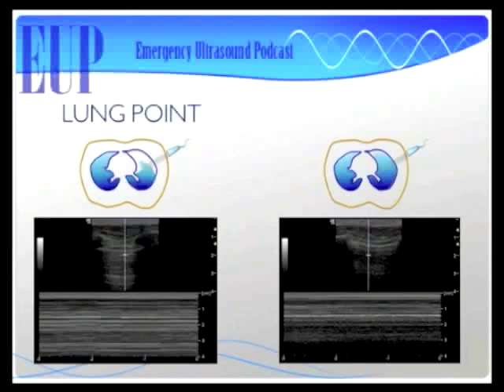Yeah, so think about it. Say you do your ultrasound initially right next to the sternum, and it's positive for pneumothorax, and then you start going laterally, and your lung point's like 3 centimeters away. That's a tiny pneumothorax, right? Yeah. But if you start going laterally and you get all the way down to the axilla before you see any sliding lung, that's a pretty big pneumothorax. Okay, awesome. So that's how you can use the lung point.